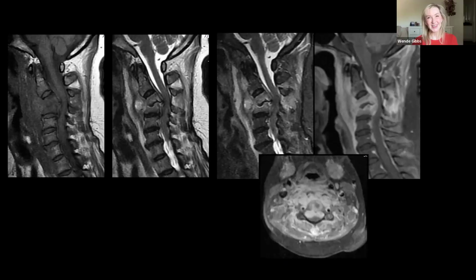Okay. See, this is why this is so valuable, Mike, because I would ask you the same question. What I was taught by one of the spine experts, actually one of my attendings in fellowship, when I asked this question, he said, if you have all enhancement and no central non-enhancement, that liquefactive necrotic stuff, then that is phlegmon.